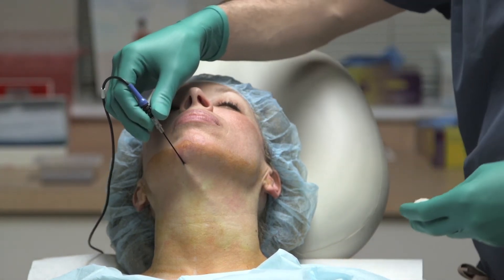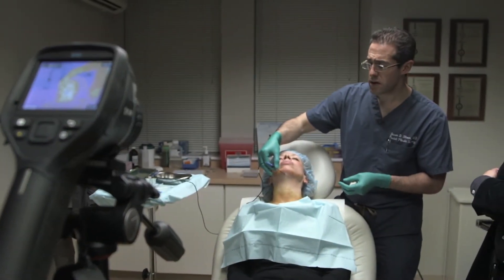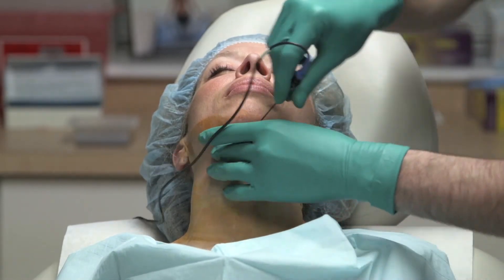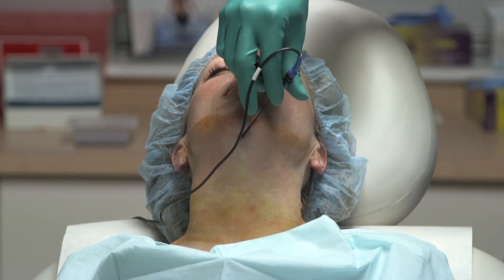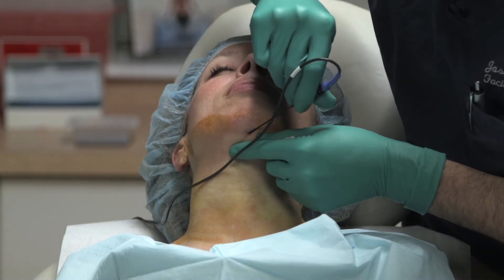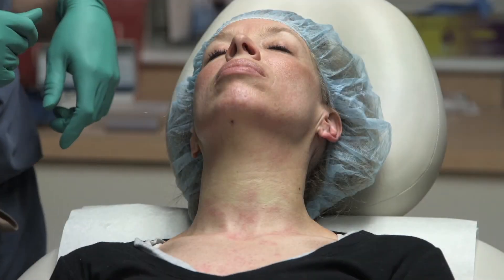After the lateral neck is treated, the submental area is also treated in that same subcutaneous or pre-platysmal plane. Because the platysma is dehiscent in the midline, you can angle the probe more deeply into some of the subplatysmal fat in order to help melt that as well.